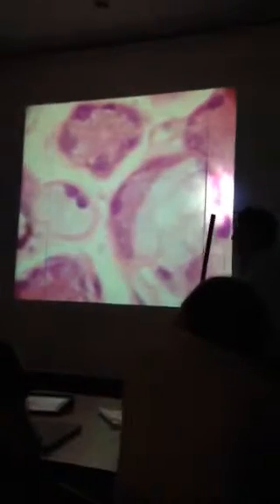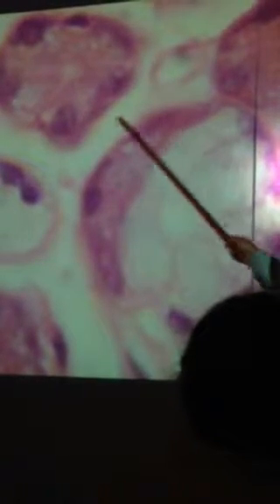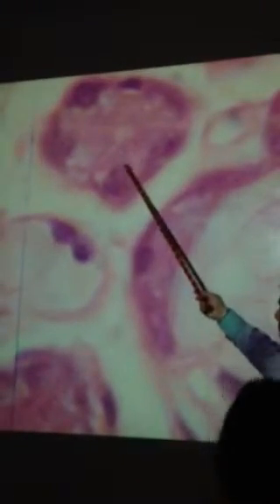All right, now what are we looking at? This is another one. Got to go back and think. Do you know this one, Abby? Probably submandibular. Parotid's almost all serous, okay? This one has mucus acini with serous demilunes. See this crescent-shaped thing? See how it comes to a point there, a point there? See how you have this crescent moon-shaped thing? That's called a serous demilune. Here's a serous acinus. Here's a mucus acinus. Remember, the submandibular is kind of mixed. But that's clearly a serous demilune.